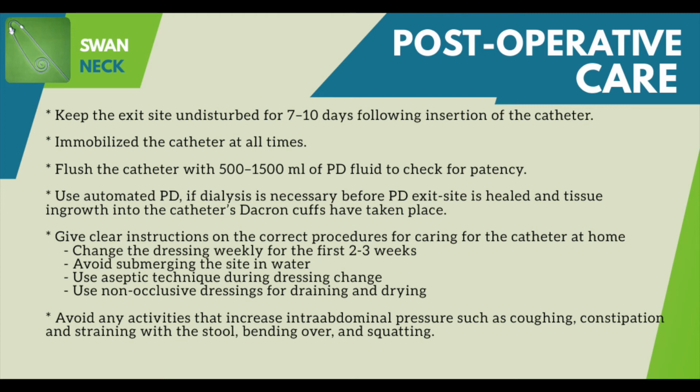Also, instruct the patient to change the dressing weekly for the first 2 to 3 weeks. Avoid submerging the site in water during this time to prevent any waterborne organisms. Use aseptic technique during dressing change. Use non-occlusive dressings so it will drain and dry rather than pool at the exit site.